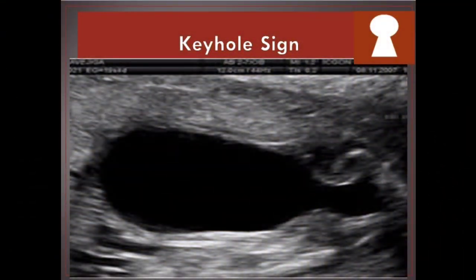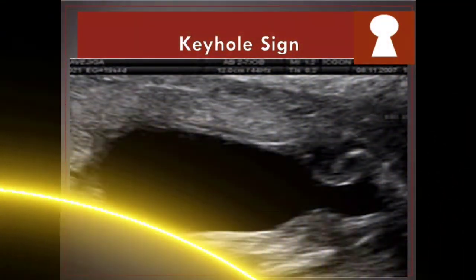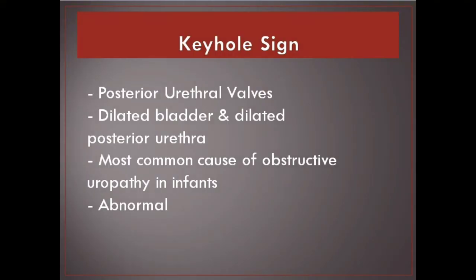Keyhole sign. Posterior urethral valves — dilated bladder and dilated posterior urethra. Most common cause of obstructive uropathy in infants. Abnormal.